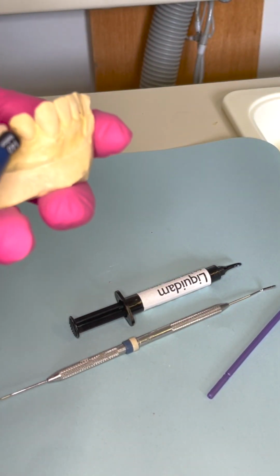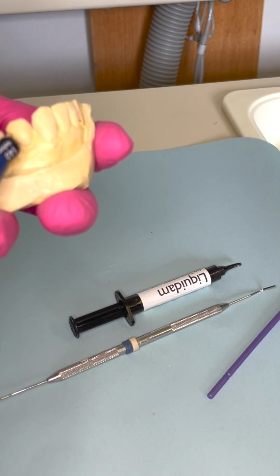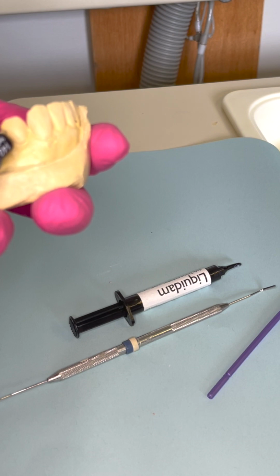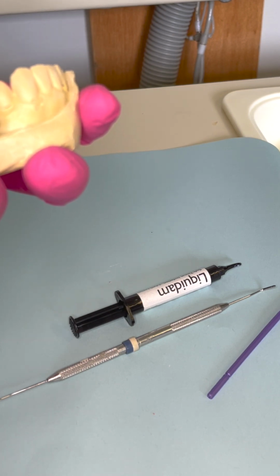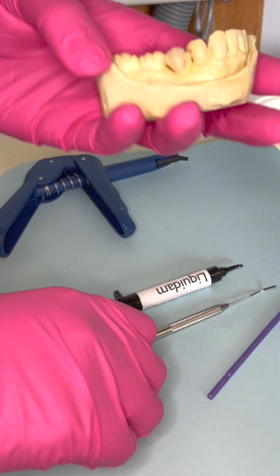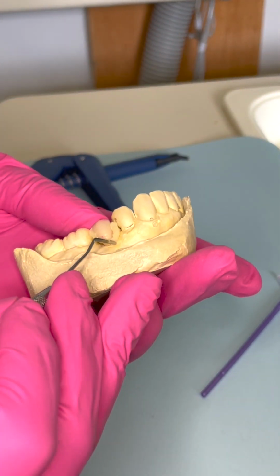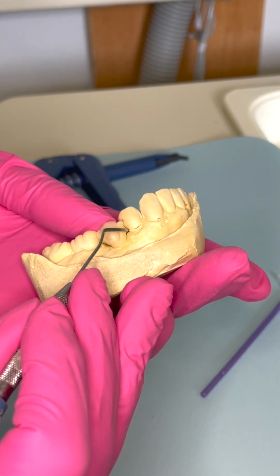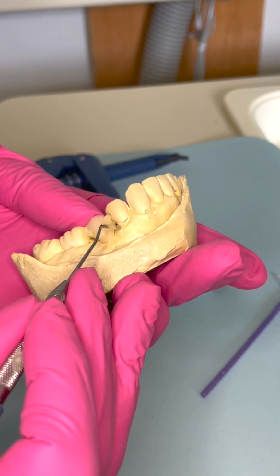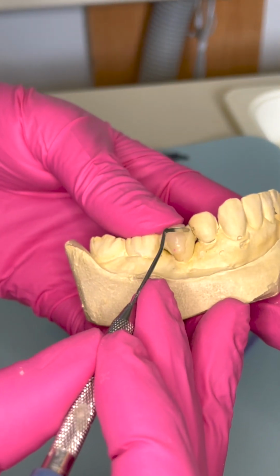You could also use liquid dam to fill in the areas, but for this I don't so much like liquid dam because I want to be able to have some time to mold things around, and you'll see how I start doing it, especially to get really nice embrasure spaces. I don't think that I can really do that if I were using, like, let's say flowable or liquid dam.